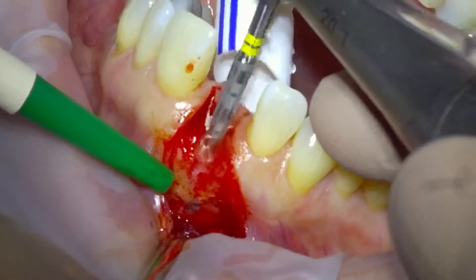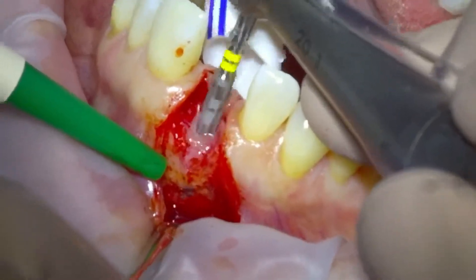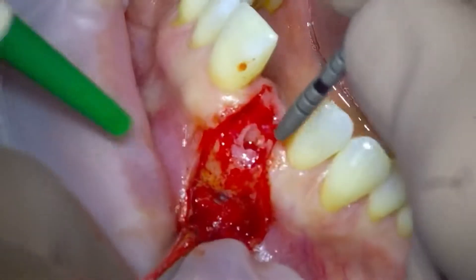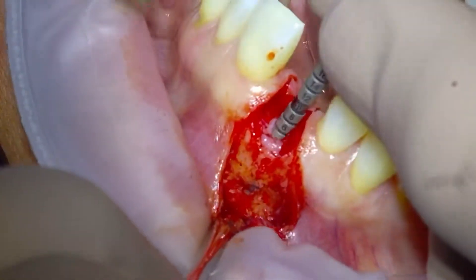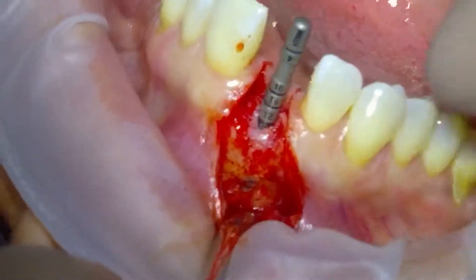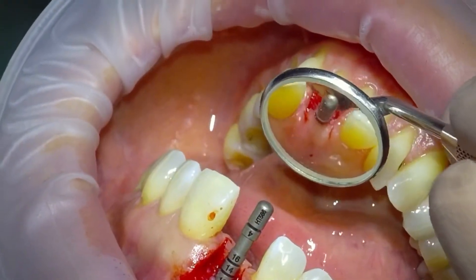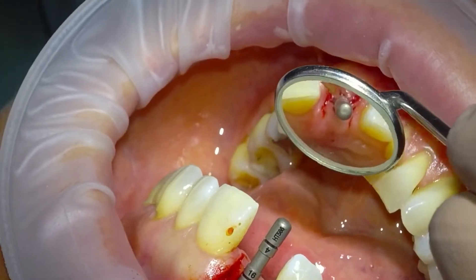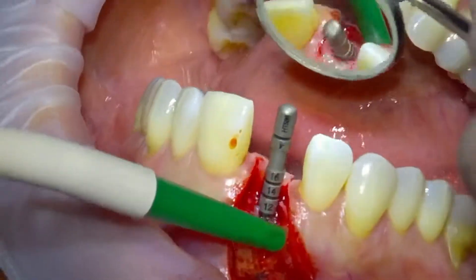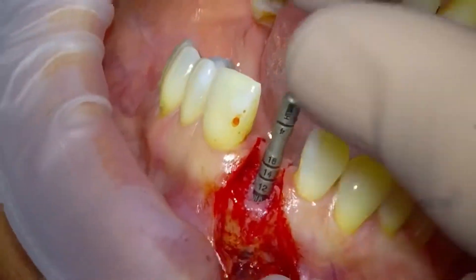We're aiming for a screw-retained restoration and you can see that we're maintaining the burr within the bony volume. That's our final direction indicator — it shows we've got good bone on the buccal aspect, but we're just going to need to rebuild that corner on the coronal shoulder. Good angulation for a screw-retained crown, and good angulation in general.